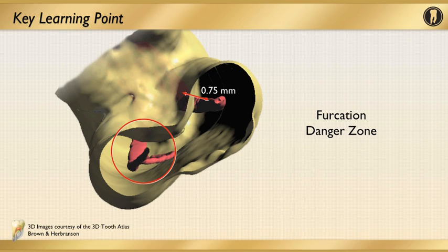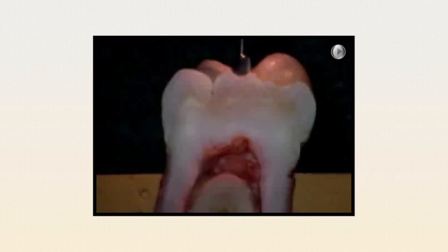This needs to be considered at the time of access so that we can remove interferences which may introduce problems in this area. Believe it or not, the crucial aspect for overcoming these problems occurs during the access preparation through direct line access and removal of coronal interferences through the use of radicular refinement and also access refinement burrs. This is an example of the initial penetration phase for a mandibular molar access.